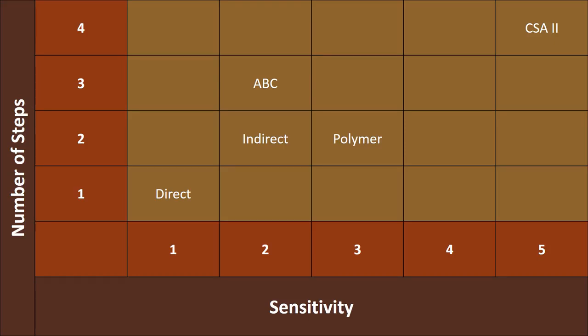The most optimal IHC procedure is the polymer-based IHC. The first step is to attach the primary antibody. The second is to apply the polymer complex, which is already conjugated with label molecules and secondary antibodies. Thus, polymer chemistry is the most effective IHC procedure.